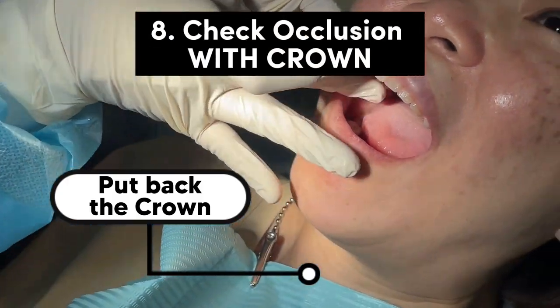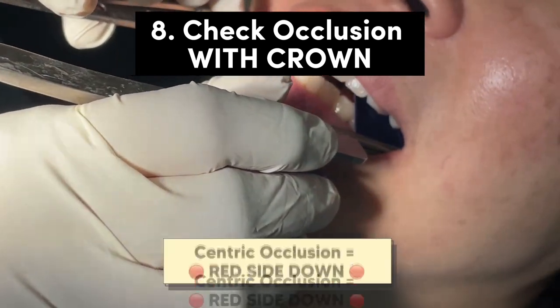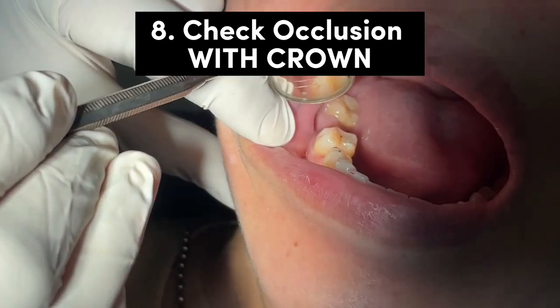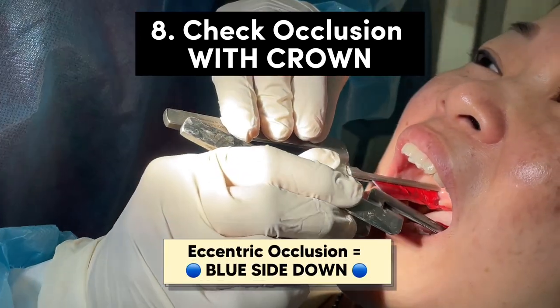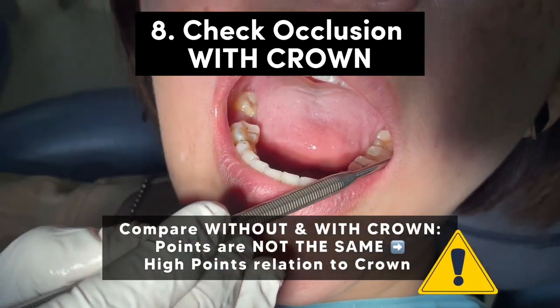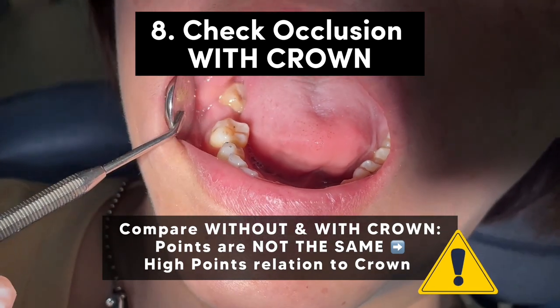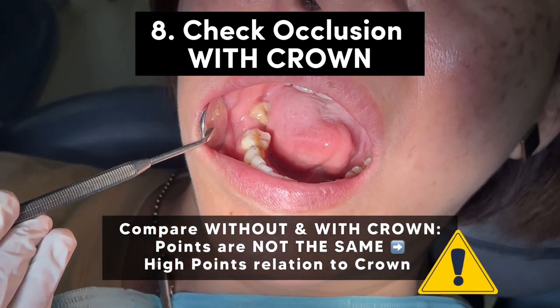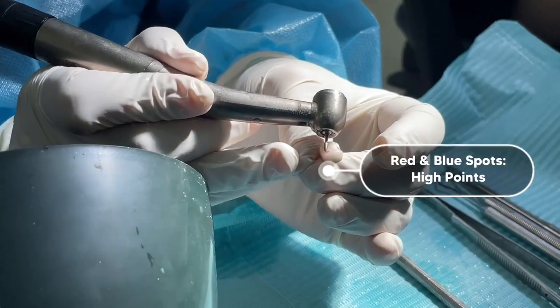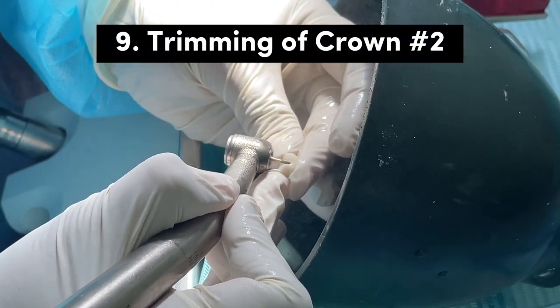Next, we put the crown or multi-unit bridge inside the patient's mouth and repeat the sequence — centric occlusion with the red side, then eccentric movements with the blue side. We compare with and without the crown to see whether the markings are the same. If they are not the same, you have high points. On the single jacket crown, you can see red and blue points related to high points, and we trim those points accordingly. Once trimmed, it is placed back into the patient's mouth and confirmed with articulating paper again.